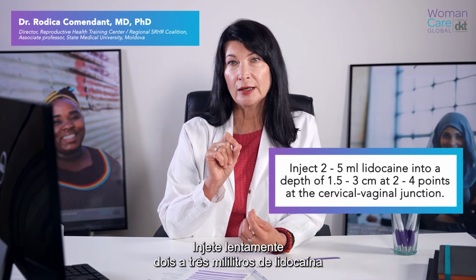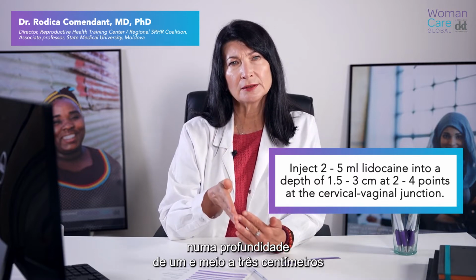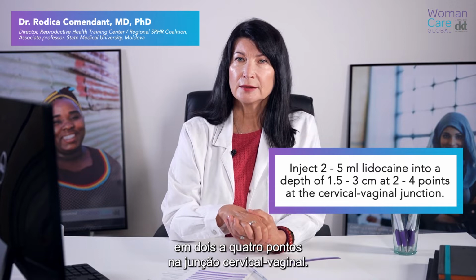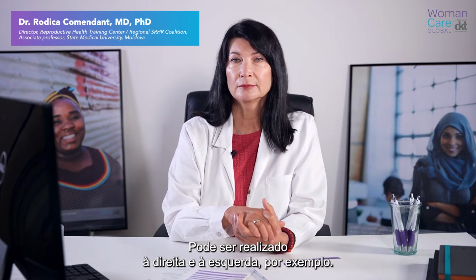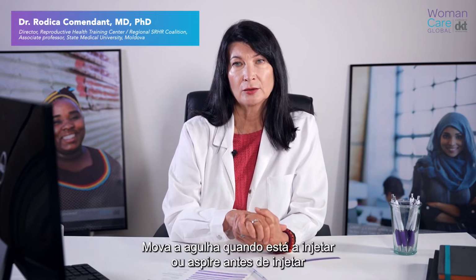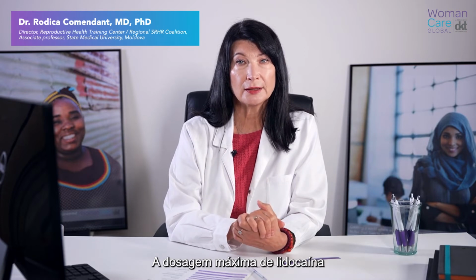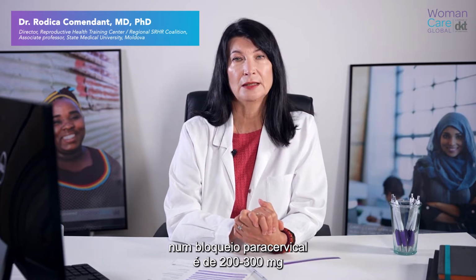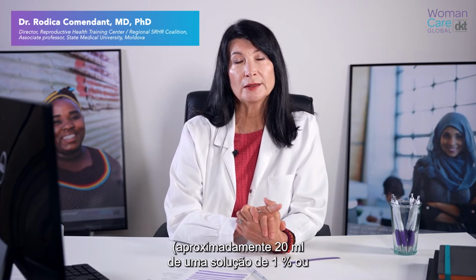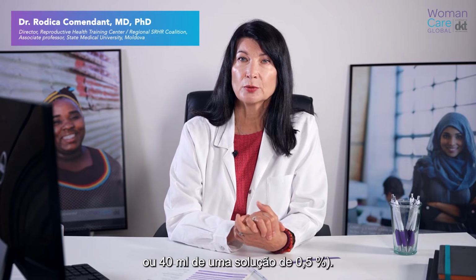Slowly inject 2 to 5 milliliters lidocaine into a depth of 1.5 to 3 centimeters at 2-4 points at the cervical vaginal junction. It can be done at 4 and 8 o'clock, for example. Move the needle while injecting or aspirate before injecting to avoid intravascular injection. The maximum dose of lidocaine in a paracervical block is 200 to 300 milligrams, approximately 20 milliliters of 1% solution or 40 milliliters of 0.5% solution.